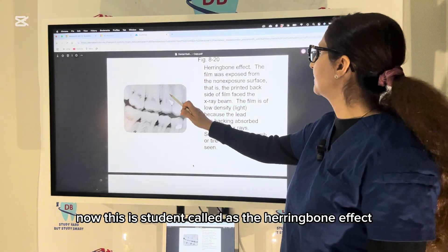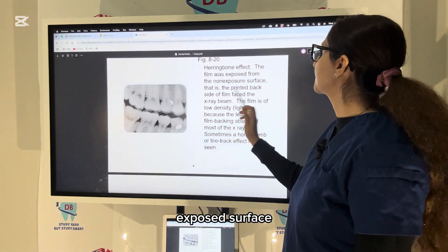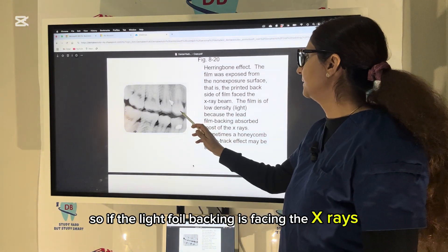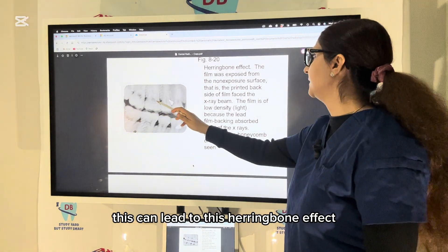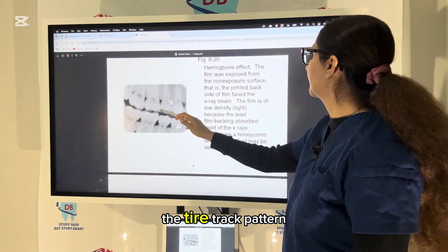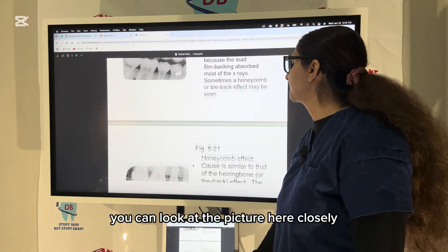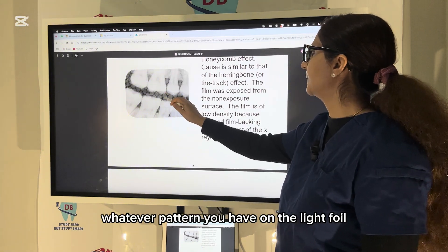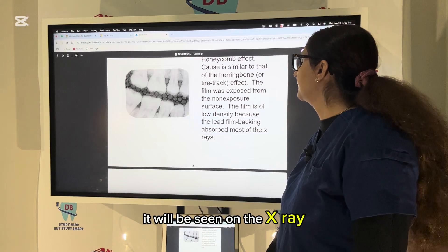This is called the herringbone effect — the film was exposed from the non-exposed surface, meaning the lead foil backing was facing the X-rays. You can see the tire-track pattern or honeycomb effect. Whatever embossed pattern is on the lead foil will be seen on the X-ray when the film is exposed from the wrong surface.